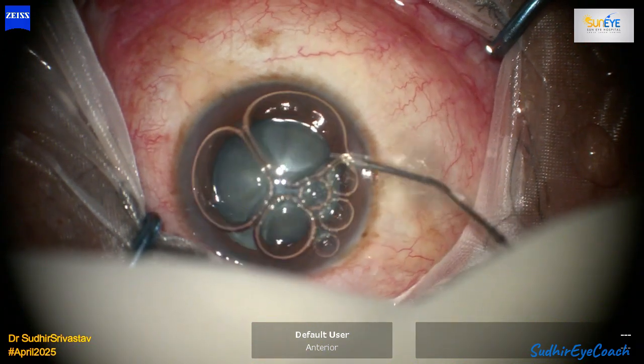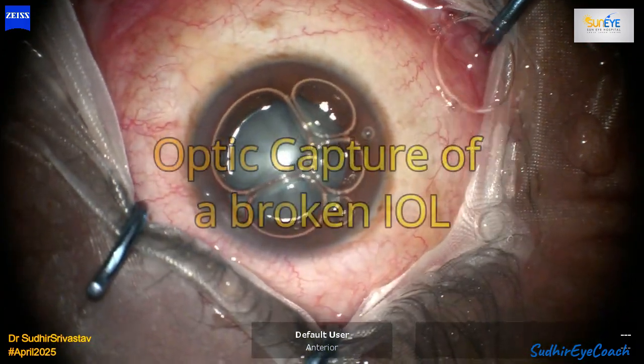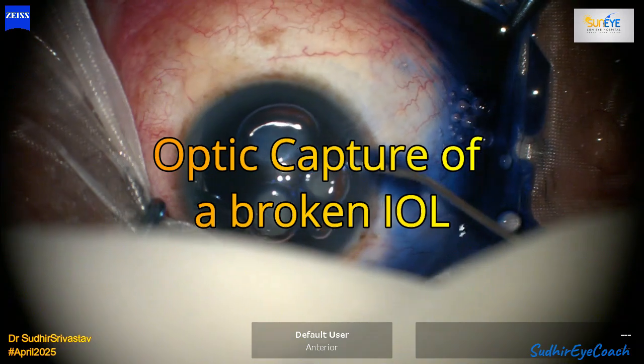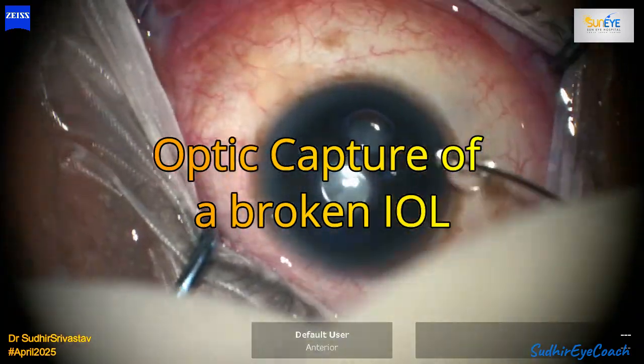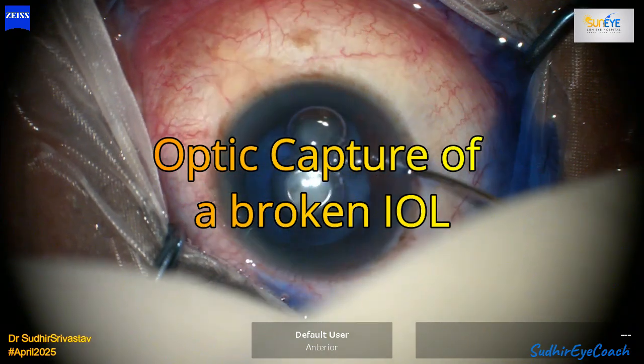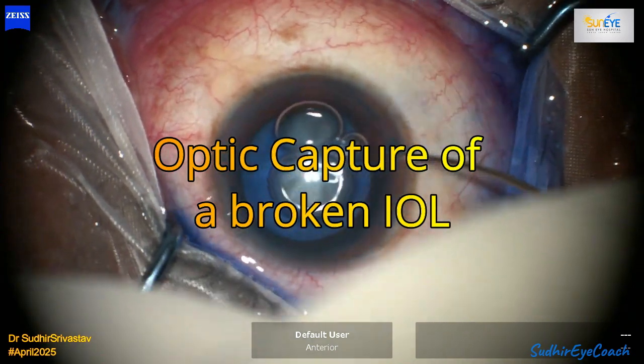Hello everyone, welcome to Sudhir I Coach, a channel for budding and emerging ophthalmologists. Today I'm going to share a very interesting case involving an intumescent cataract. As we all know, performing a capsulorhexis in an intumescent cataract is difficult and can be quite tricky due to high intralenticular pressure.